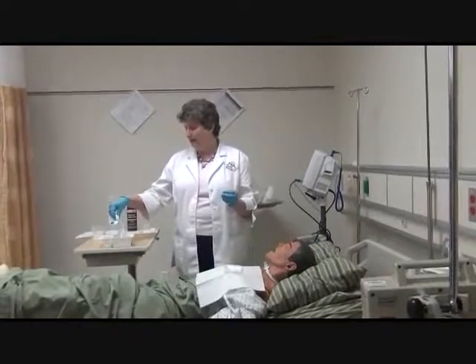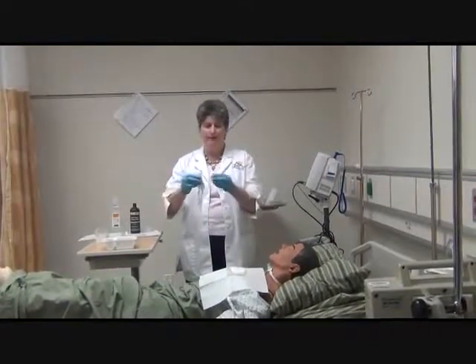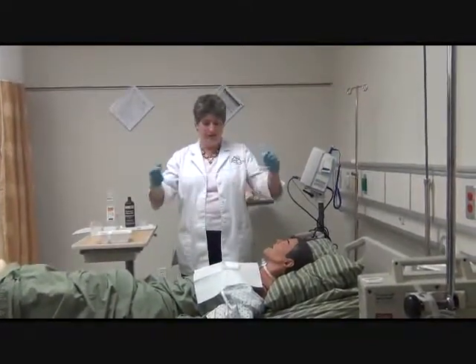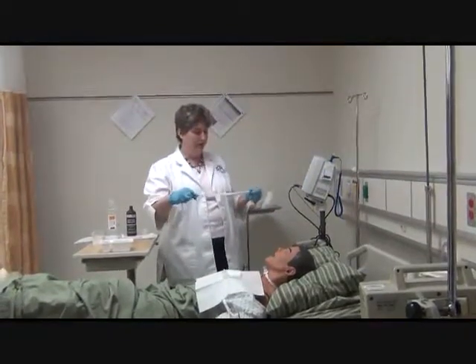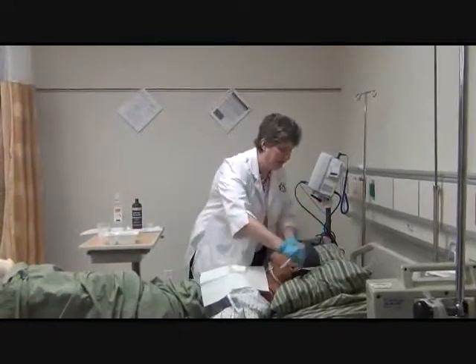I also should have a tie of some type in there, and at this point with my patient, I've moved my gown's ties down. I'm going to put this behind my patient's head.